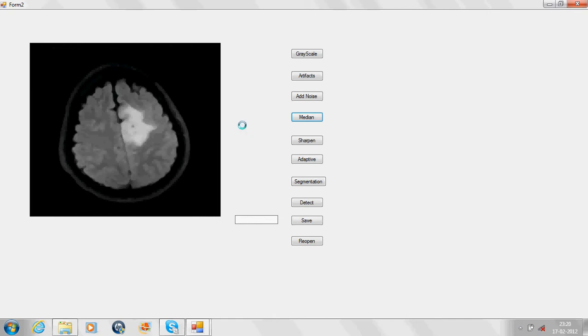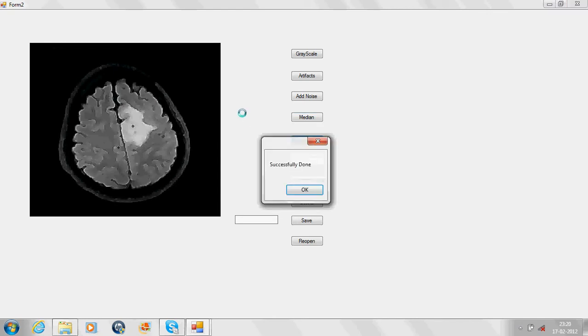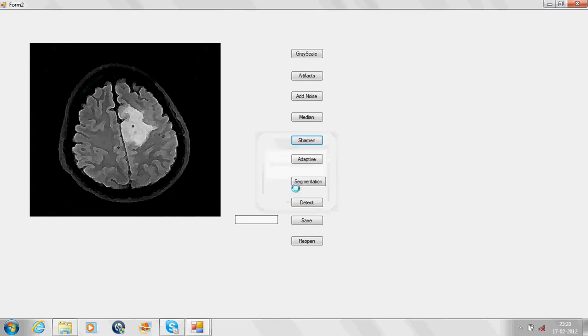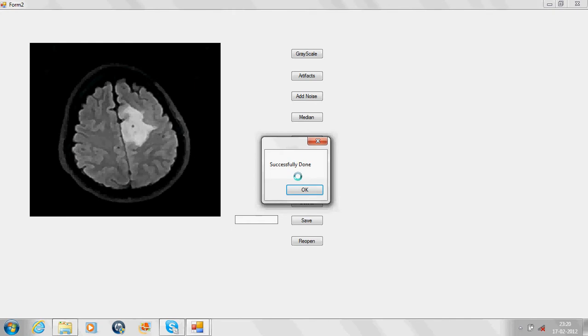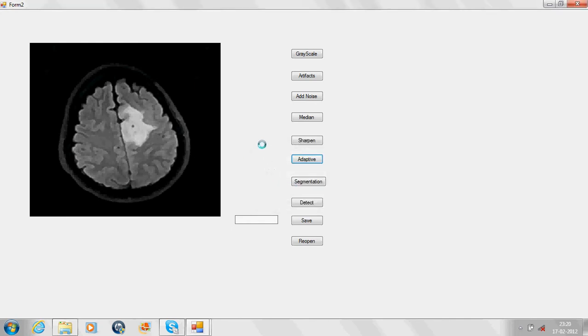The next part is enhancement of the image, which means brightening the image. On the click of the sharpen tab, the image will be enhanced. If it is too much enhanced, we can smoothen it through adaptive smooth. Now the image is ready for the segmentation module.